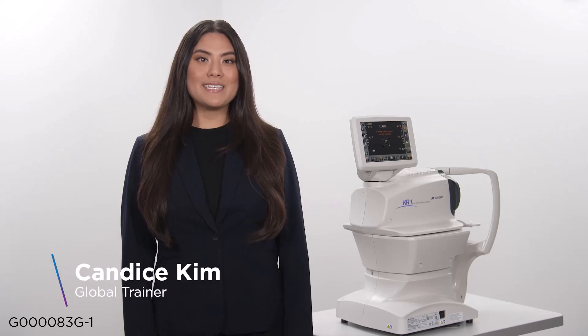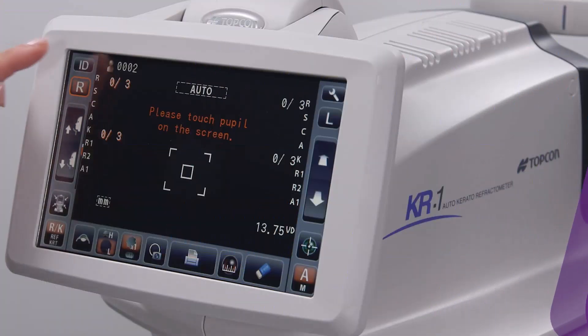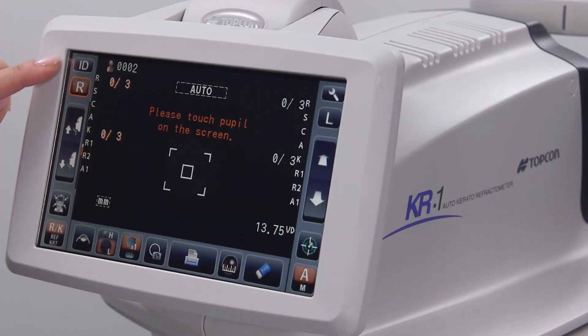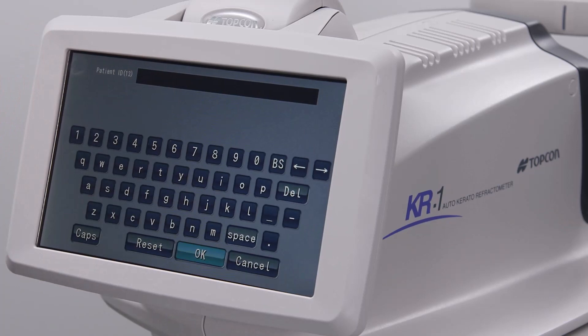In this video, we will be discussing the various button icons on the touch screen of the KR1. At the upper left of the screen is a patient ID icon. By clicking on this, you can manually enter identification for the patient. Otherwise, the device will auto-generate a number.